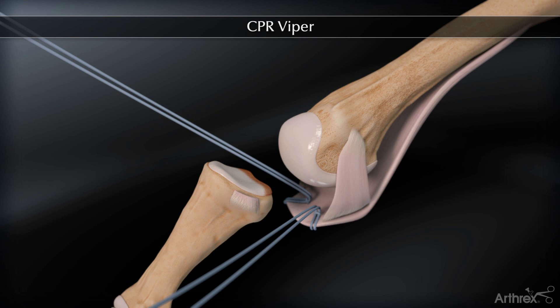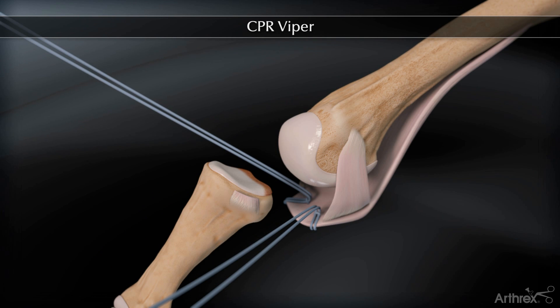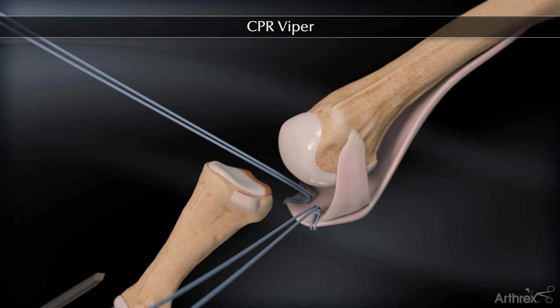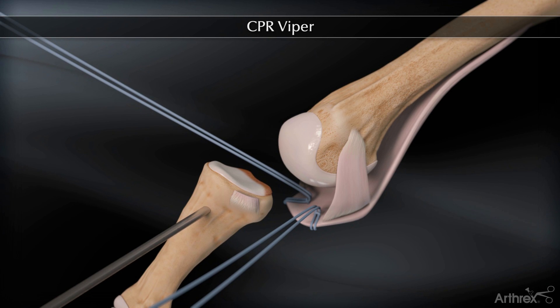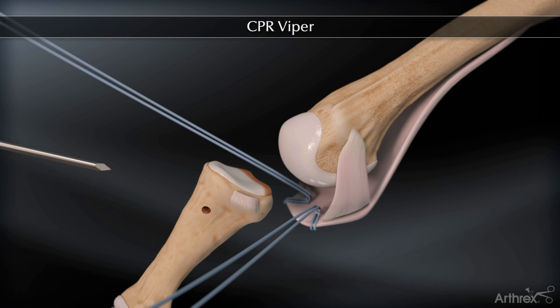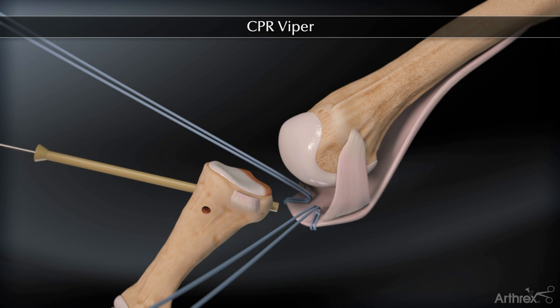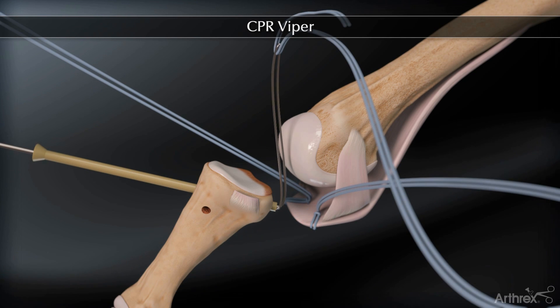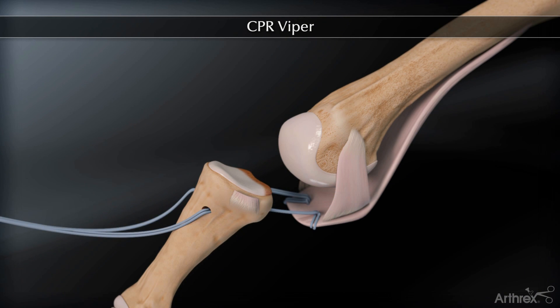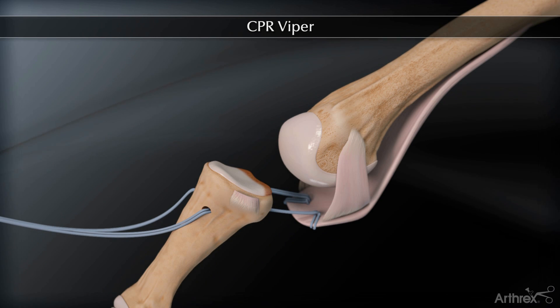Sometimes the VIPER is used to place one or two horizontal mattress sutures if the surgeon so desires. The distractor and K-wires are removed from the metatarsal and phalanx. We then use a small 90-degree towel clip around the phalanx to maximally plantar flex the phalanx when drilling the cross 1.6mm drill tunnels in the phalanx. It is critical to see the K-wire exit on the plantar surface. Then, using the Arthrex peak tube and suture passers, we pass those sutures through the tunnels in the proximal phalanx.